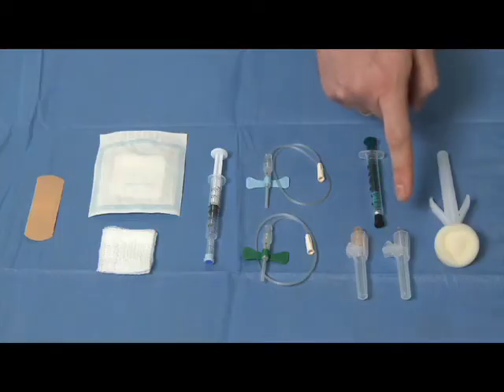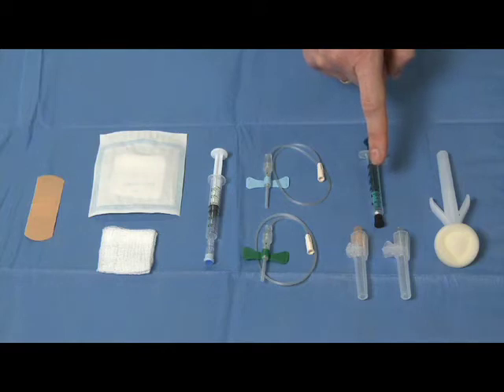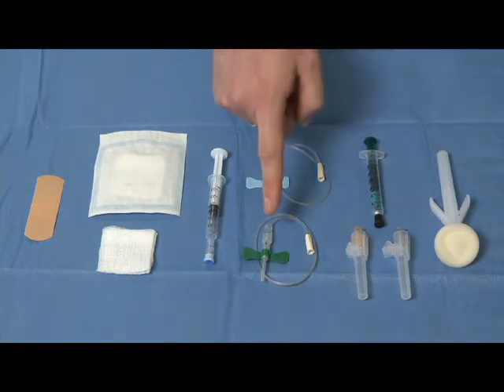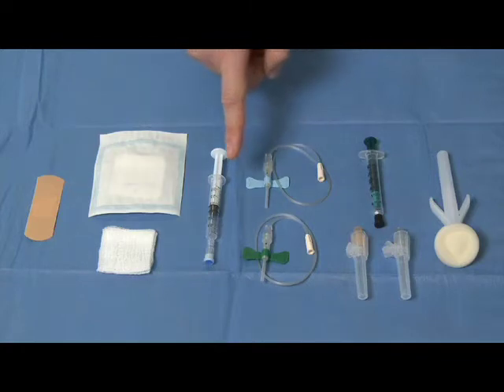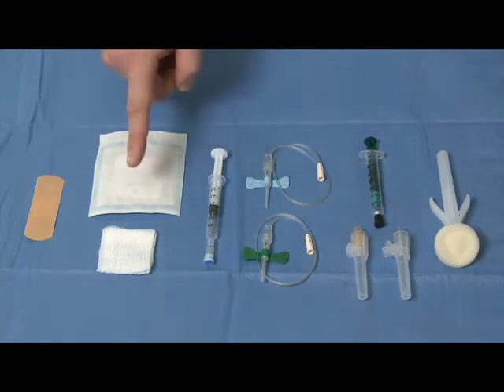Also needed is an ABG kit including 22 gauge to 25 gauge needle and heparinized syringe system, 1 cc to 3 cc, or a separate 22 gauge to 25 gauge needle and manually heparin-coated 1 cc to 3 cc syringe, and sterile gauze and Band-Aid.